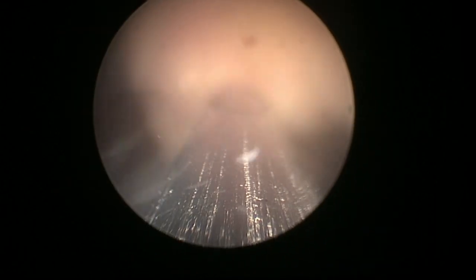So sometimes I don't use a second irrigation. Some people use a second irrigation because they feel that the inflow is better and they feel more safe having a second irrigation. But with the Wolf system, what I have seen is that the amount of water coming in and the water coming out with morcellation is quite balanced. So the bladder keeps distended throughout the procedure. The only thing you have to keep in mind is to check that the morcellation is efficient.